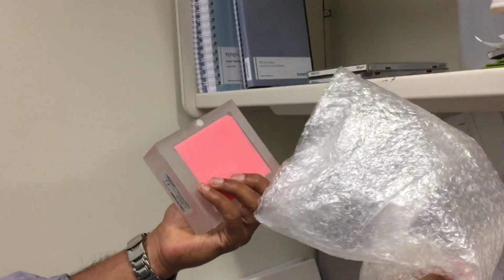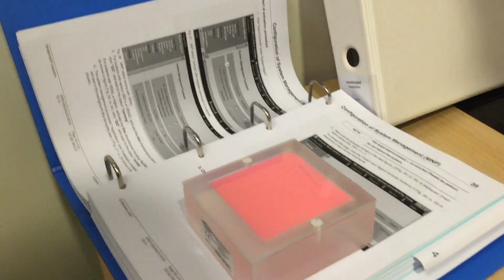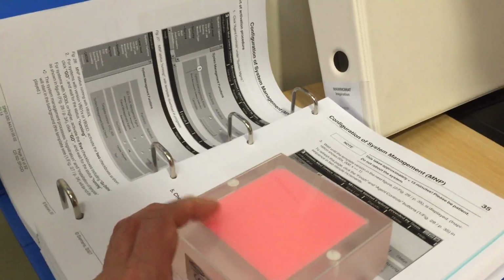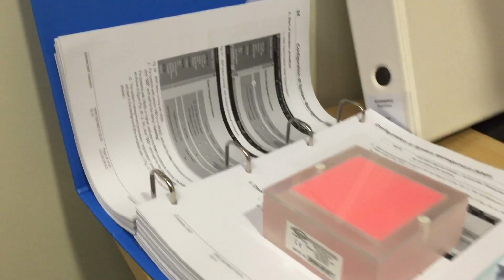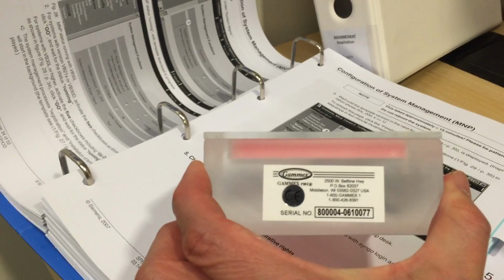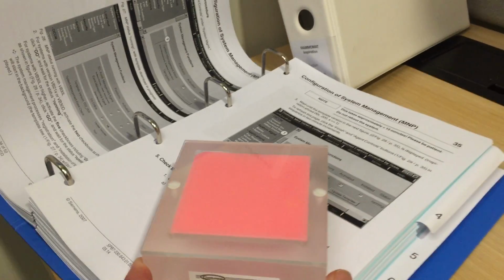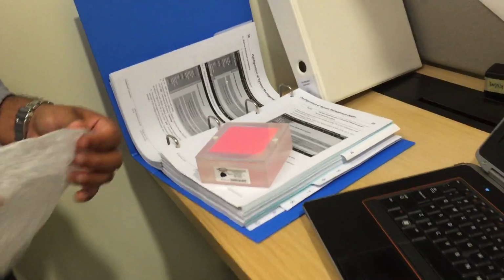This is a phantom. Wow, this is good. I keep asking Hassan, right? Can I look at more? Phantom for which QC then? For the biopsy or general? Not sure. Oh, there are different GAMMEX, of course, GAMMEX. Different sizes and thicknesses for the detector calibration.